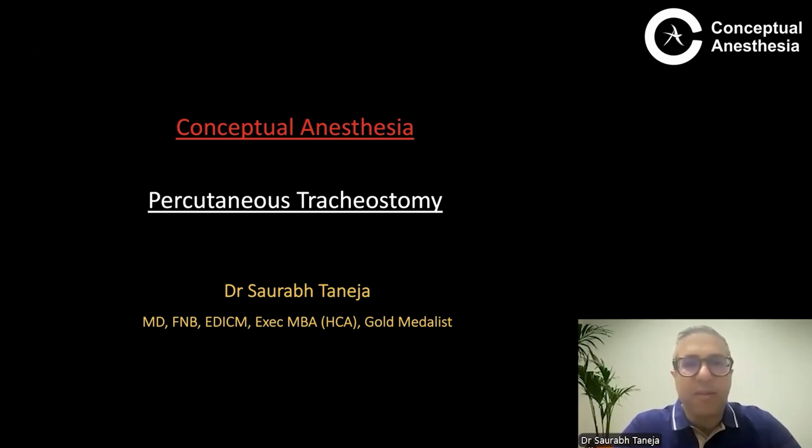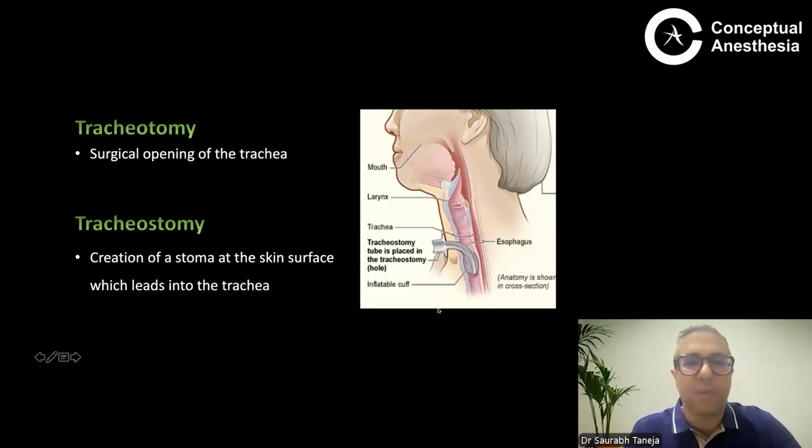So as an anesthesiologist or a budding intensivist or someone looking at critically ill patients, you should be familiar with how to manage a tracheostomy, how to do a tracheostomy, this procedure. We'll be talking about this procedure in a bit of detail and how it is different from surgical tracheostomy. I will also tell you how over time it has become much safer to do a percutaneous tracheostomy in the ICU. We'll be starting with the talk.